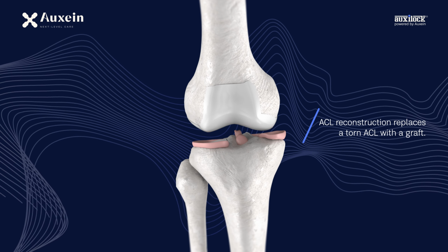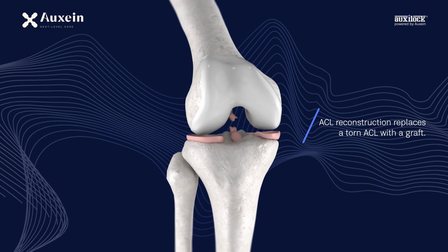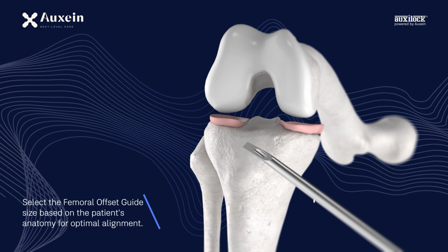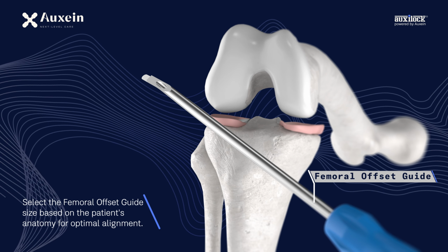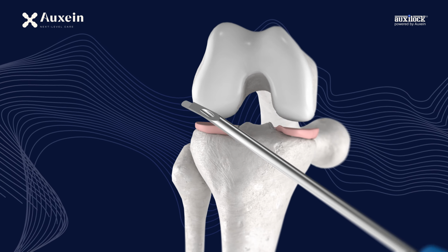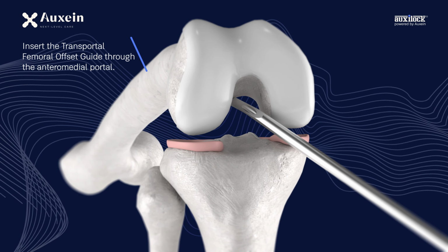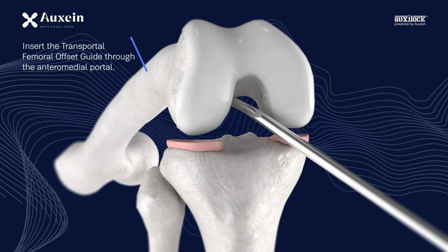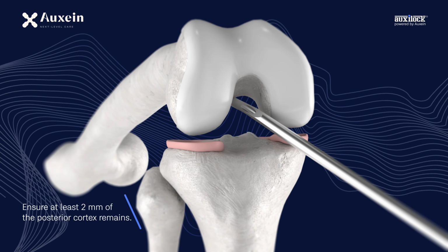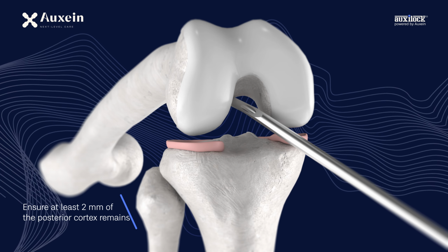ACL reconstruction replaces a torn ACL with a graft. Select the femoral offset guide size based on the patient's anatomy for optimal alignment. Insert the transportal femoral offset guide through the anteromedial portal. Ensure at least 2 mm of the posterior cortex remains.